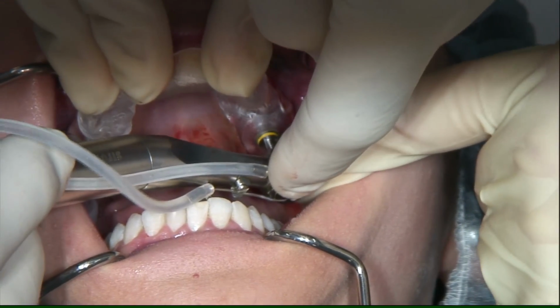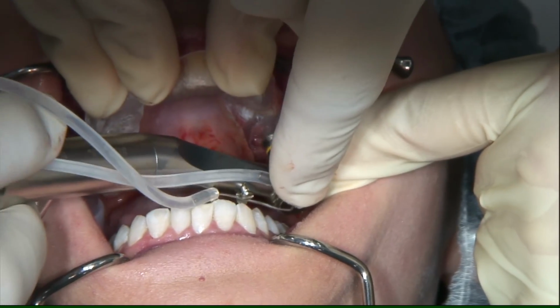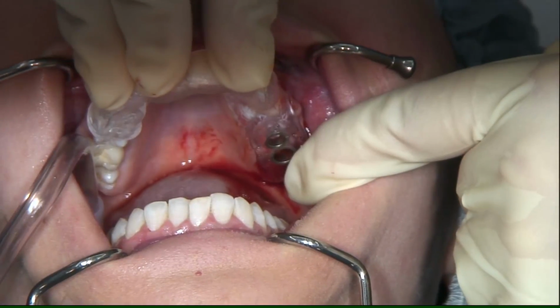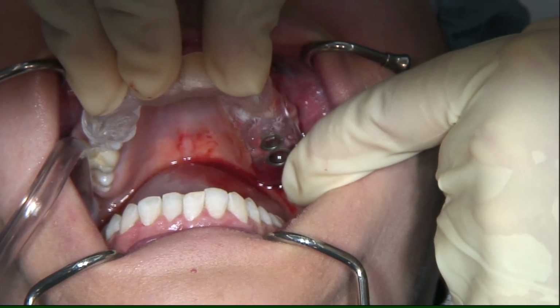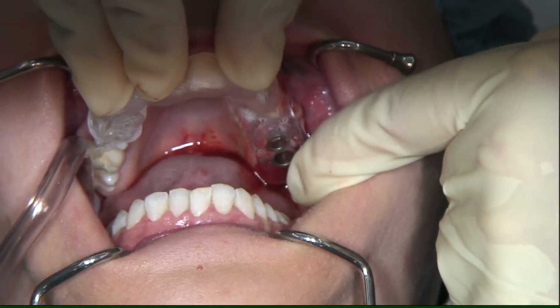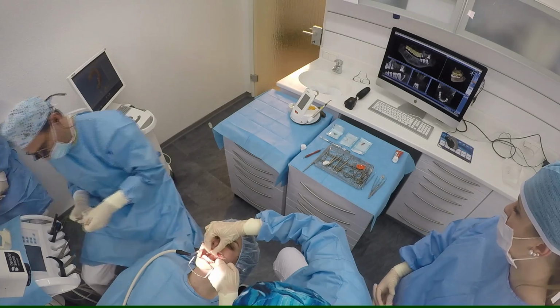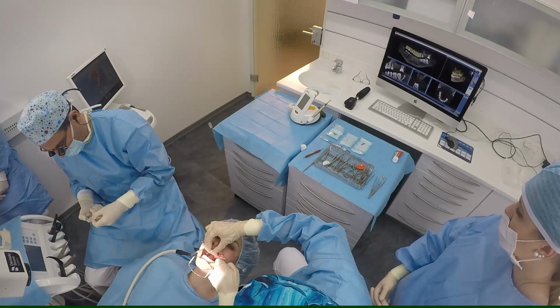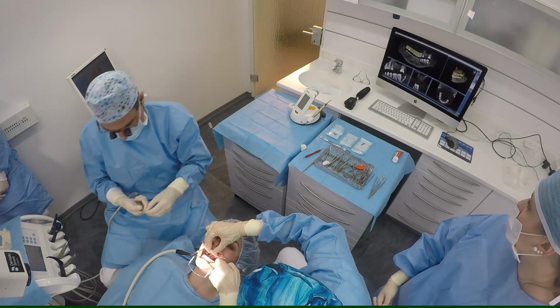And this is a sleeve-in-sleeve system. The idea is now to do some center punch with a full diameter drill first. So just to tip with the drill to center punch the right position.